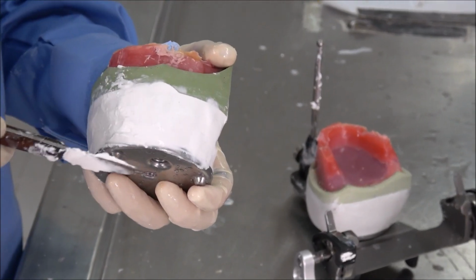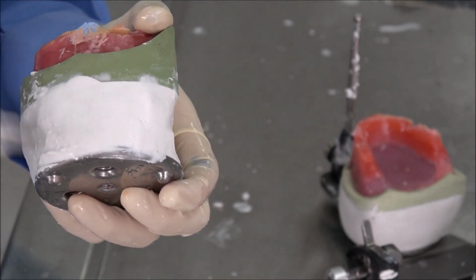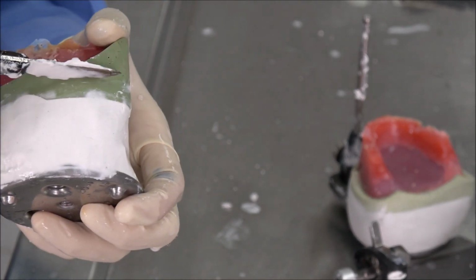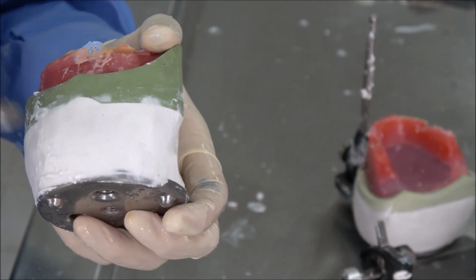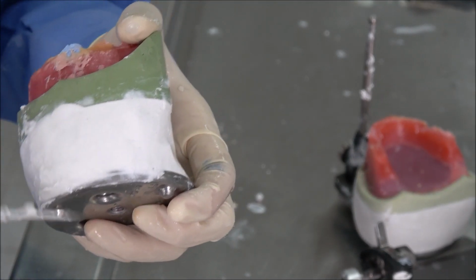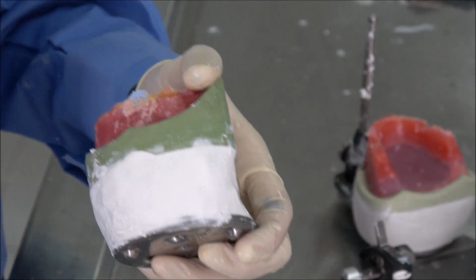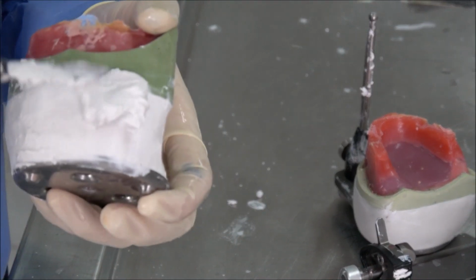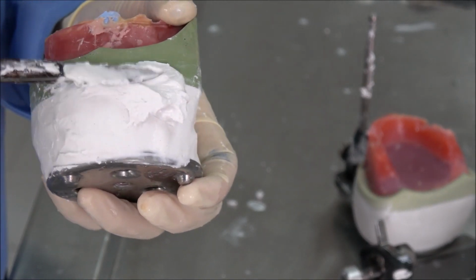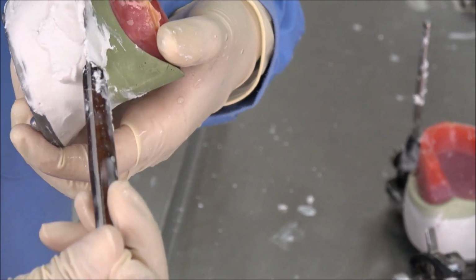Okay, for the extension of our POP, we already mentioned for the upper models, we have to cover at least half of our models. But it's okay, never mind. When we mount, maybe we don't have time, we don't have enough time, it's okay. We just leave it. Once it's set, we can add on. So we are going to add on half of the model for more retention. Make sure you add on later on. So right now, we can add on with our POP. Just add a little bit here to cover it. Cover at least half of the model.